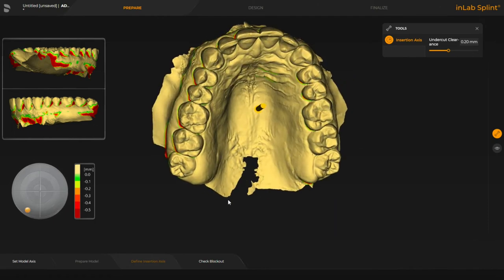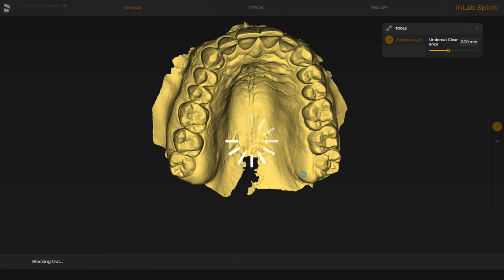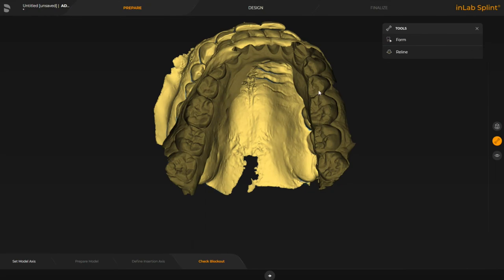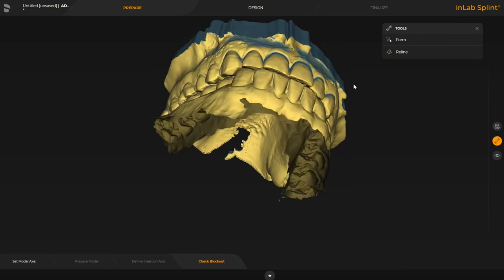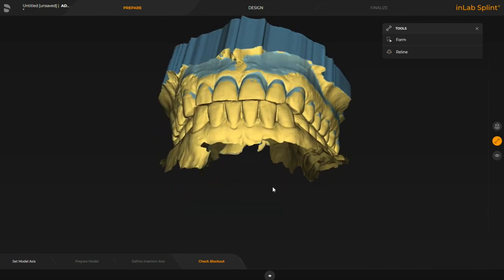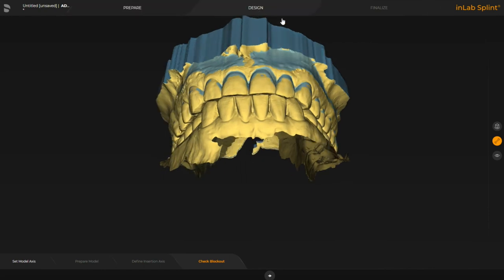The next stage is we're going to click on check block out, so it's going to automatically generate the fitting surface by blocking out the undercuts we've just selected with the insertion axis. Let this do its thing — once it's finished blocking out it'll allow us to move on to the design. You can see on the top right we've set that undercut to 0.2 millimeters. This is the block out it's designed with the undercuts we have, and I'm happy with that, so we're going to go now to the design phase.